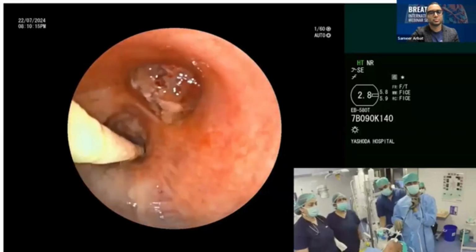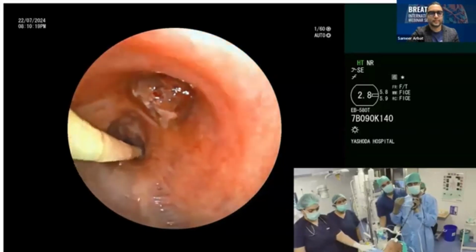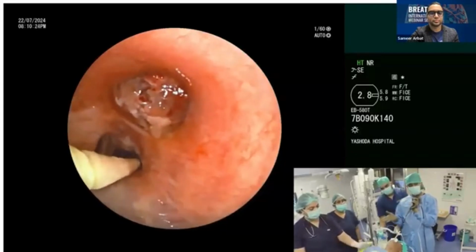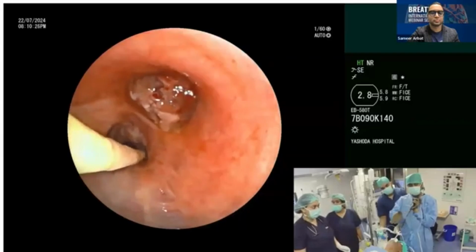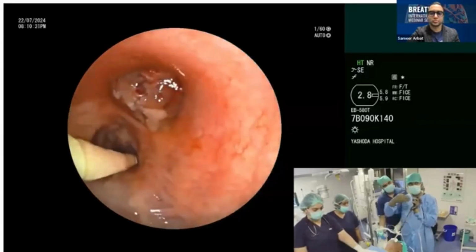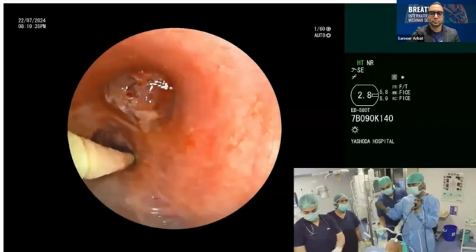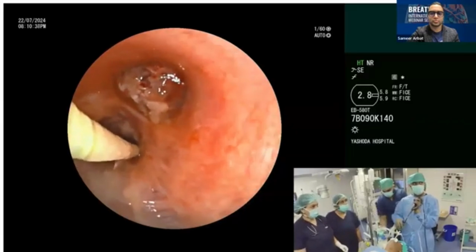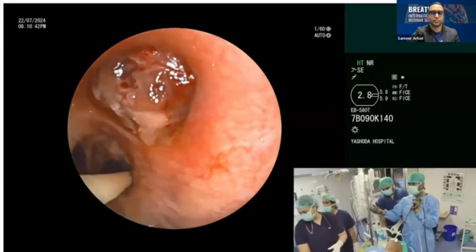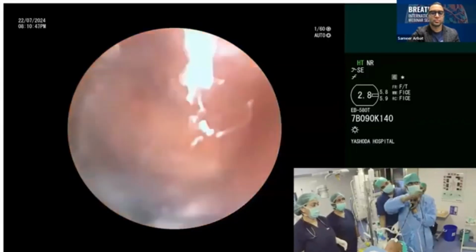Now you can see there is a big vascular fleshy tumor which is arising from the right main bronchus. Once I know that I am going to deal with a highly vascular tumor, I need to take all precautions. So I am going to tilt my bed slightly to the right so that if any bleeding occurs, it spills onto the right side and doesn't contaminate the normal left lung. In addition, I generally place the head end slightly down so that all the bleeding that comes to the trachea can be sucked by the suction catheter and will not contaminate the underlying lung.